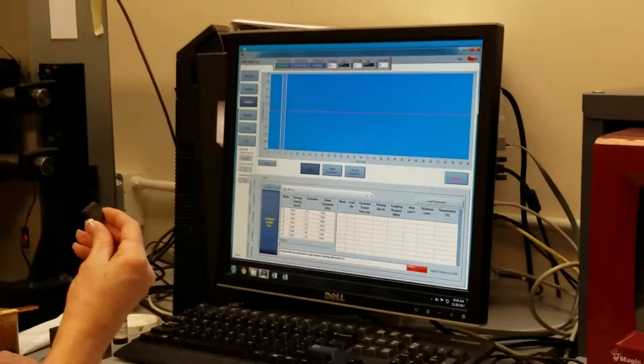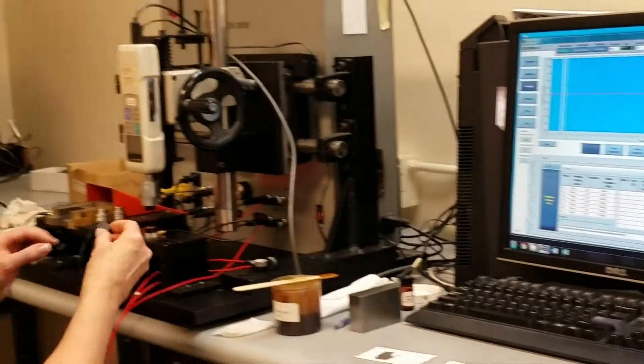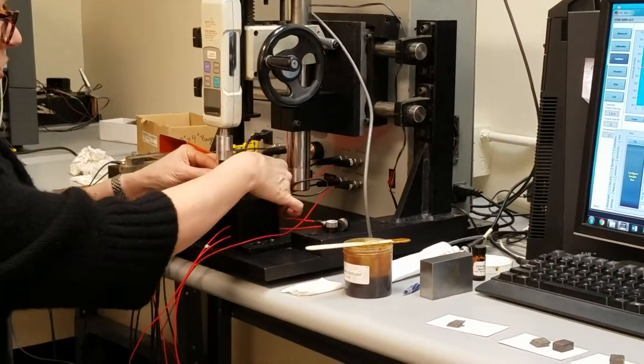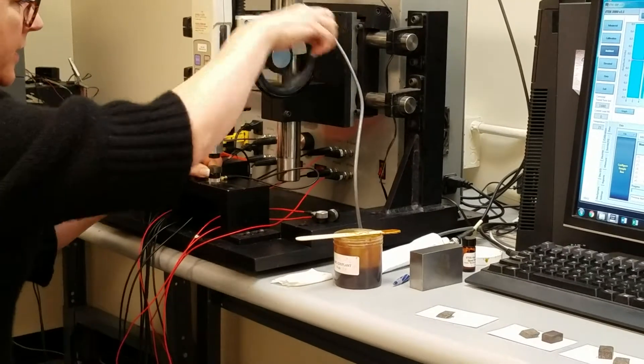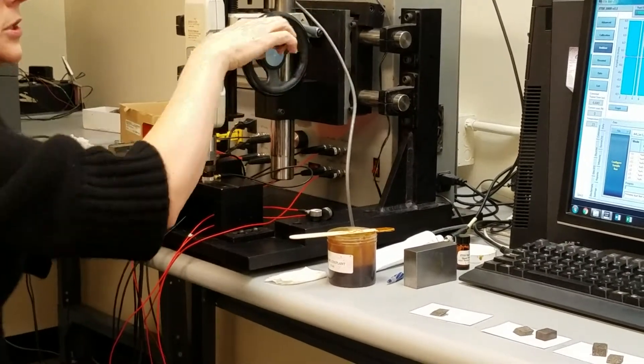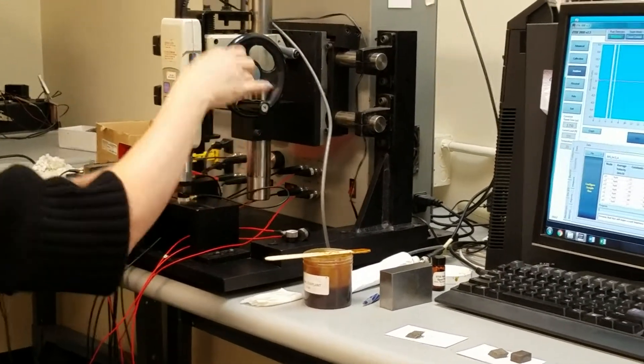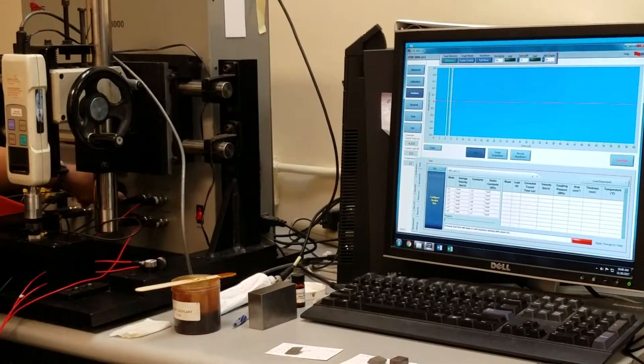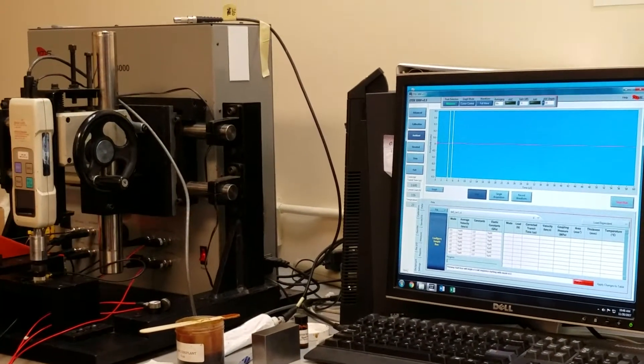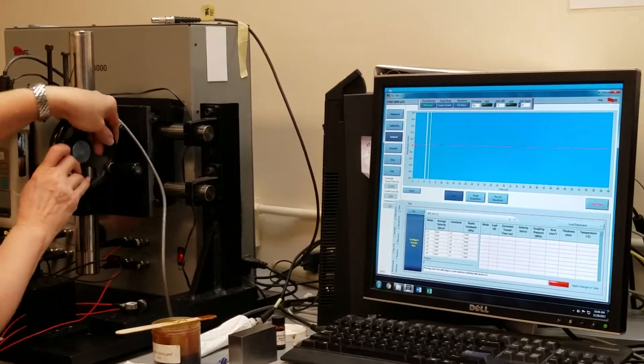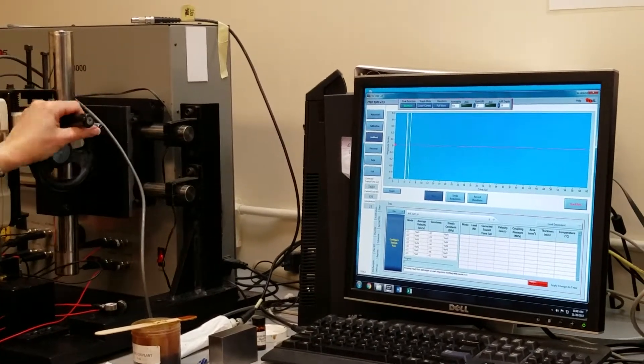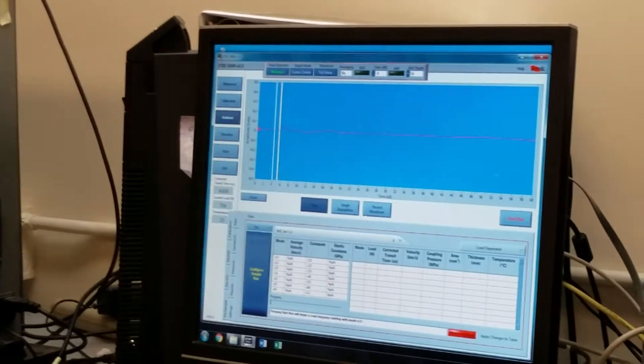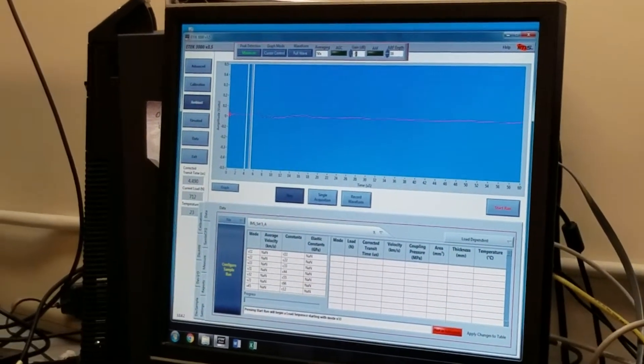I take my A sample, and I set it between the two transducers, and I start to apply load until I get a waveform on the screen. If there is any attenuation in the line, now is the time to remove it. So, I'm going to start to apply some load here.